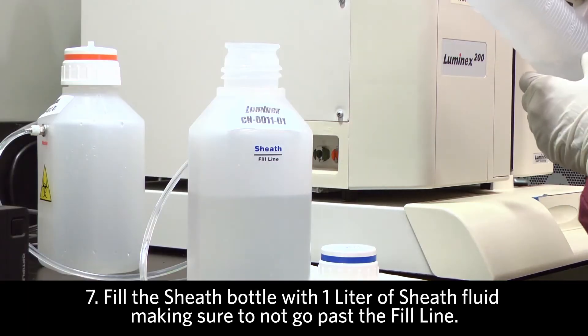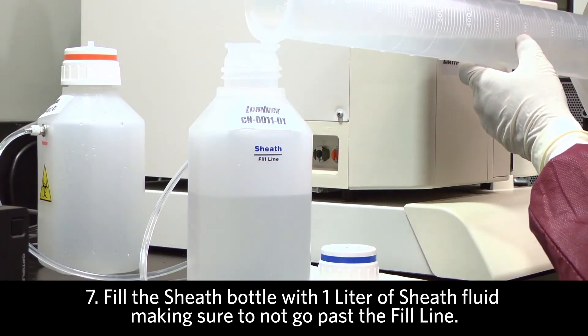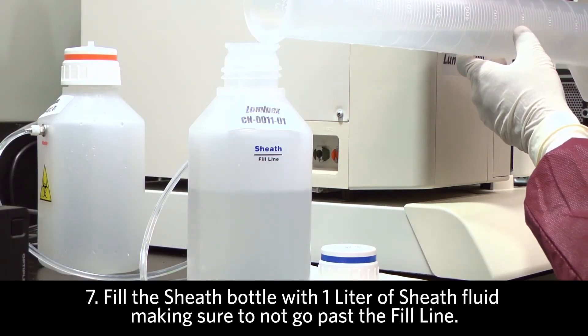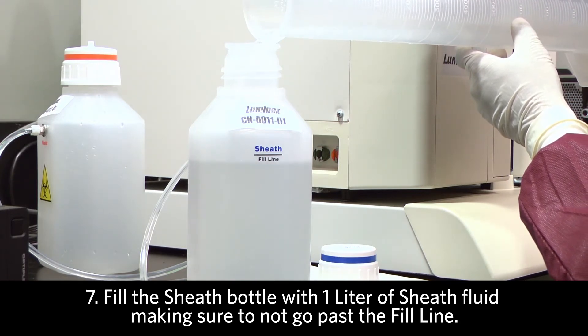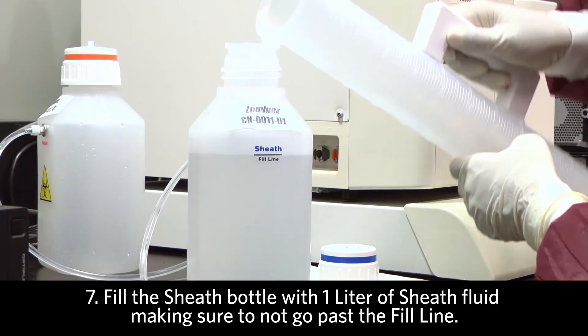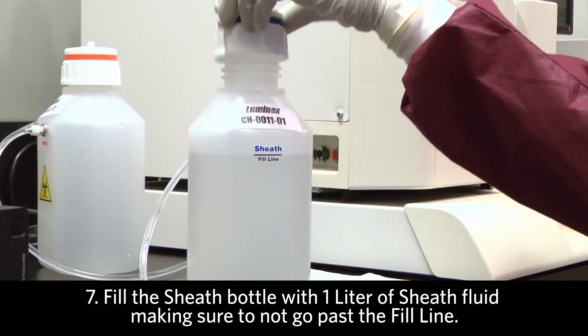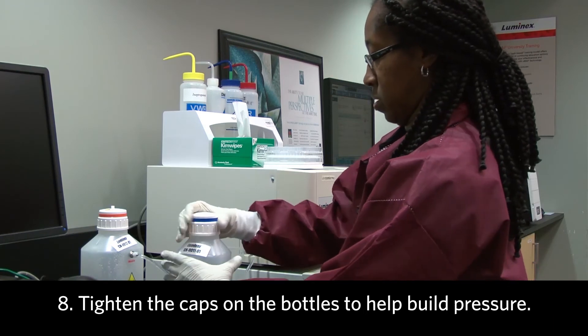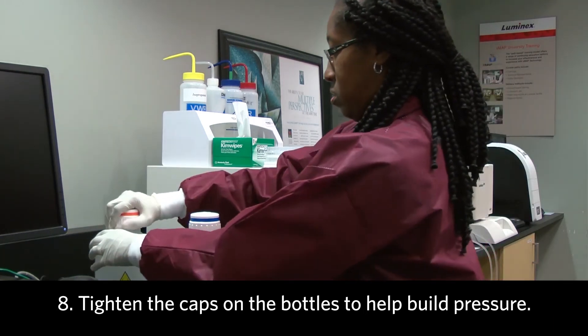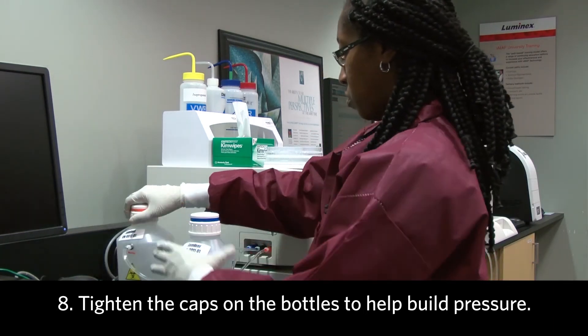The next thing to do is to fill the bottle with one liter of fresh sheath. There is a fill line and we should not go anywhere past the fill line when adding sheath fluid. Be sure to tighten the cap on the bottles, as this will help pressure build.